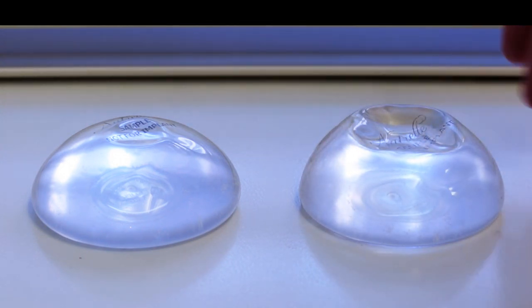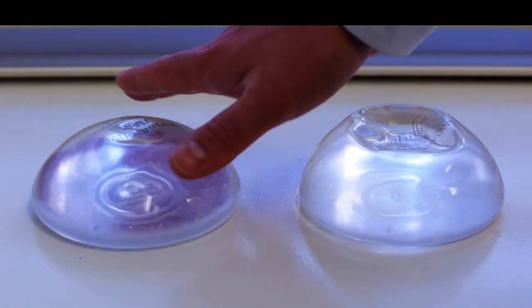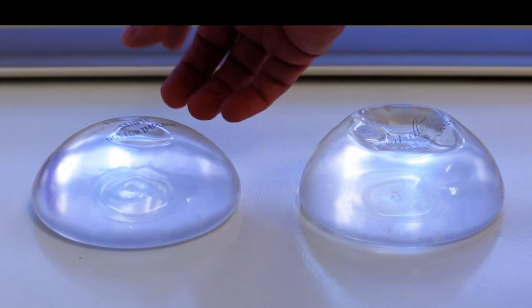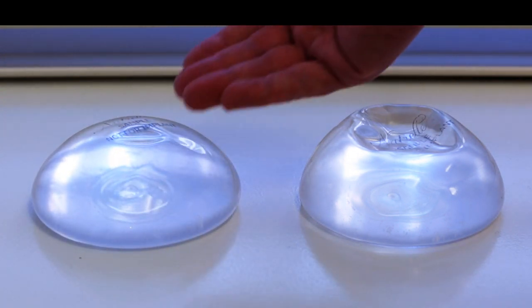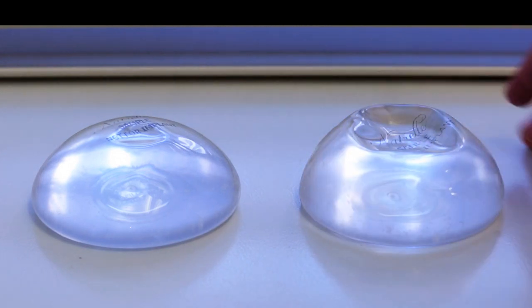So as you can see, even with both these implants sitting here on the table, the new Inspira has a much nicer shape with no, at least that we can see, rippling or wrinkling. The gel kind of fills itself out and fills the shell out, so it sits in a very natural spot.